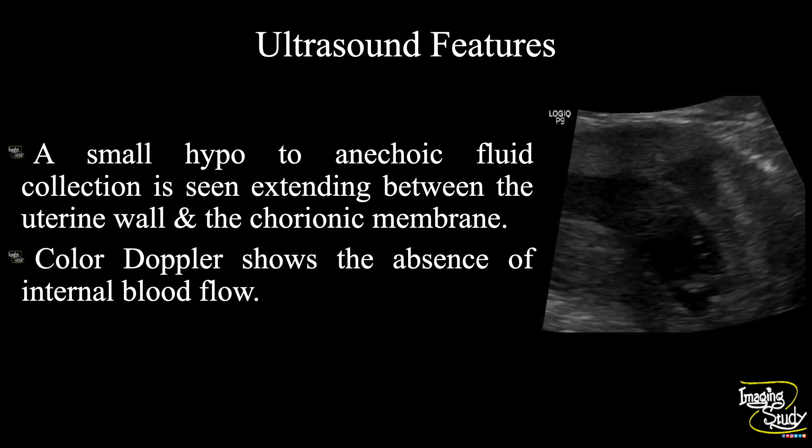In summary, a small hypo-to-anechoic fluid collection is seen extending between the uterine wall and the chorionic membrane. Color Doppler shows absence of internal blood flow. These features suggest a case of subchorionic hematoma.